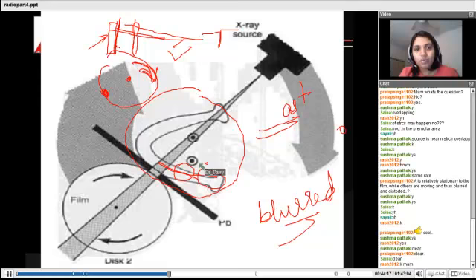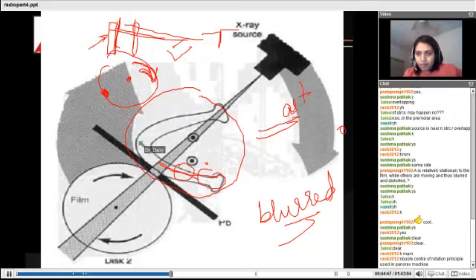Isn't it? Now, initially they used to use two-center rotation, wherein they selected a center of rotation which was very favorable to this part. When we selected two centers of rotation, we selected for this part, but for this particular part we did not get a very good center of rotation that kept the X-ray and image receptor well synchronized. That is why we got the image of this zone blurred. Yes, that is double center of rotation.